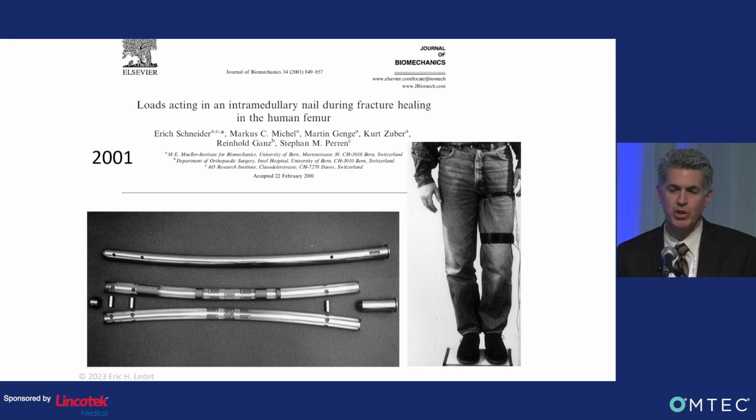Can you advance that? Thank you. Also in trauma, you can see here a femoral rod, just one example. This rod is cut in half, strain gauges, which are sensors, placed on the inside of the rod, and then laser welded back together again.